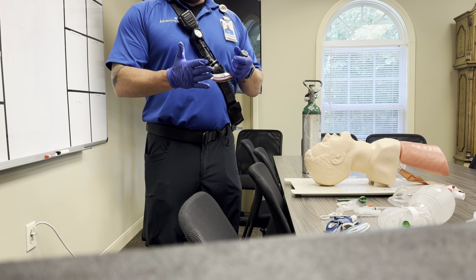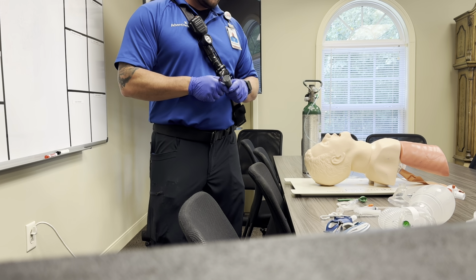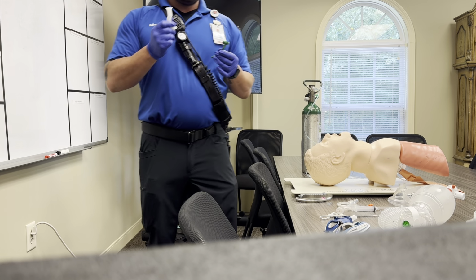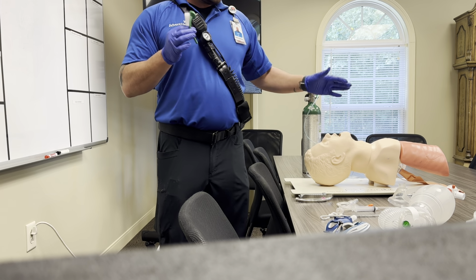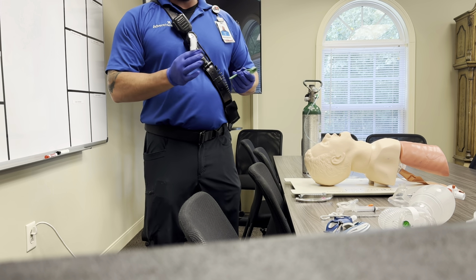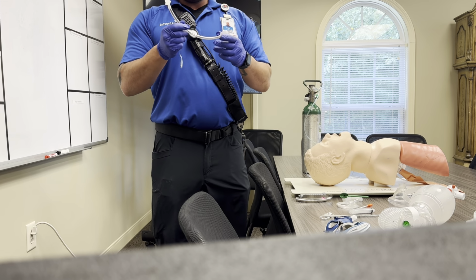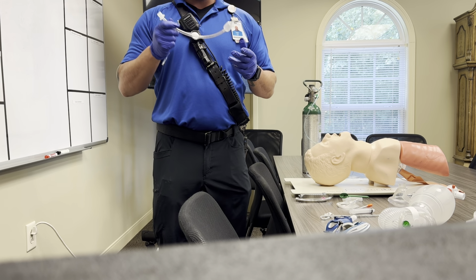Everybody always needs to make sure that the light works, the batteries are good on their laryngoscope every morning when they check your truck off. Next we'll be using just an airway adjunct, so either an NPA or an OPA. These are smaller sizes, and it's just for demonstration purposes only on this mannequin since it is a smaller mannequin, so we don't want to mess that up. We want to make sure that we do have the appropriate size ET tube. So again, for demonstration purposes on this mannequin, this is a 6.0 ET tube.